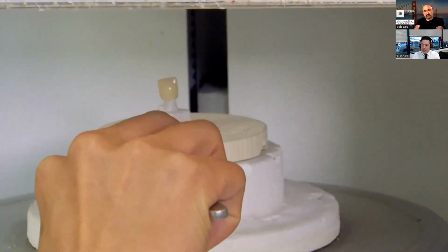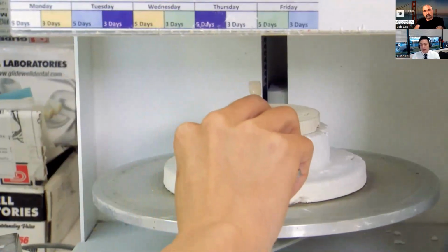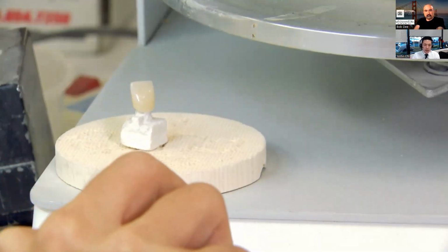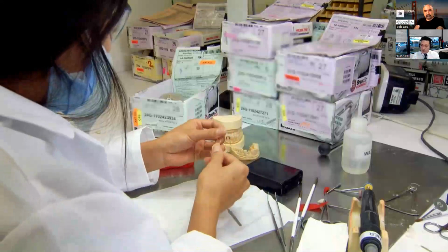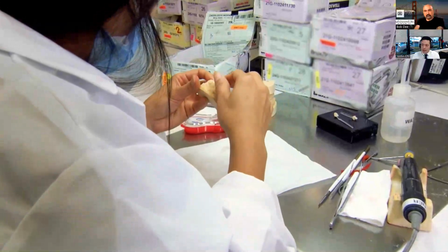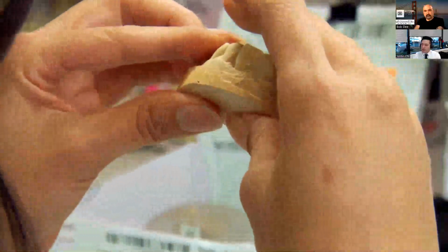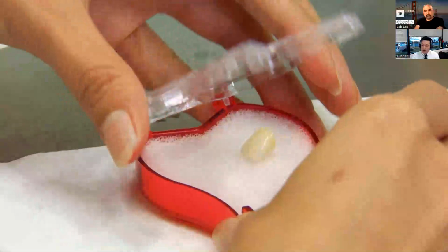So if you are sending anterior cases to the lab, it's a great idea to send photos so that we can not only match the contours of the adjacent teeth, which we also do see in the model, but also the color, which is, of course, very, very important. And if you are taking photos, be sure to take a photo with a shade tab next to the prep. That way we can color correct as needed, because depending on the settings on your camera and the lighting in your office, that could all really throw off that final photo.